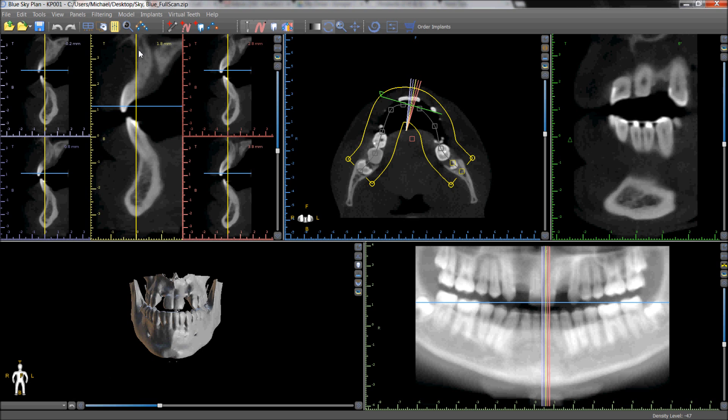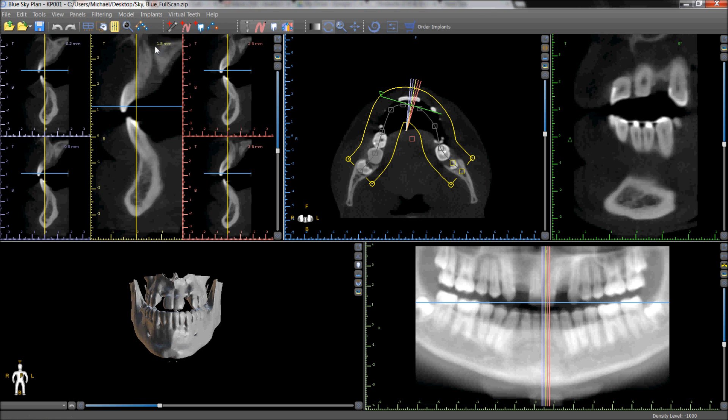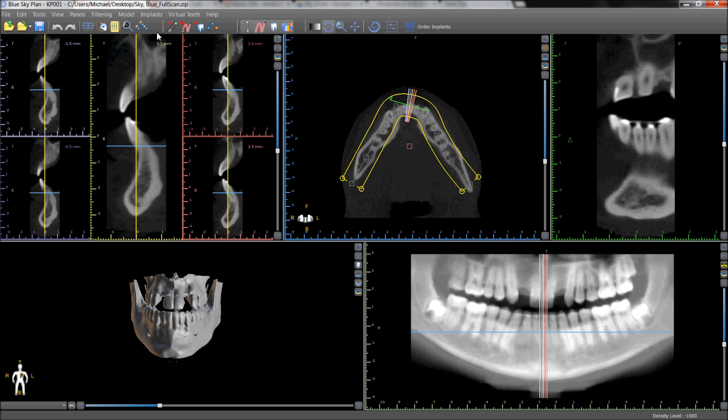The software automatically saves all three curves and the user can toggle between them and view the relevant axial slices.